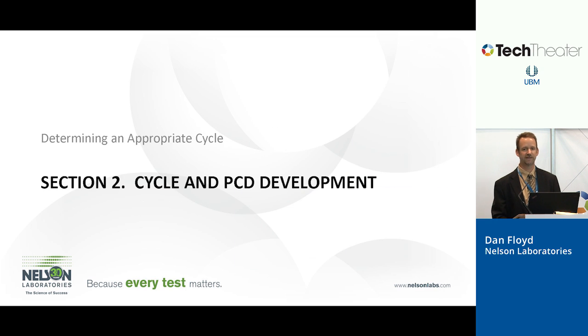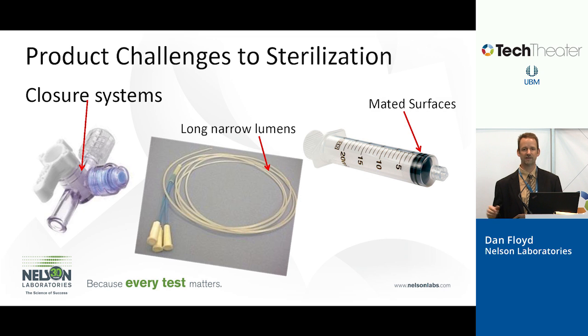So now we get into the cycle and PCD development. This is where we get into how long your sterilization cycle may need to be. When you look at your product, you have to assess all the different areas on that device that might be hard to sterilize.